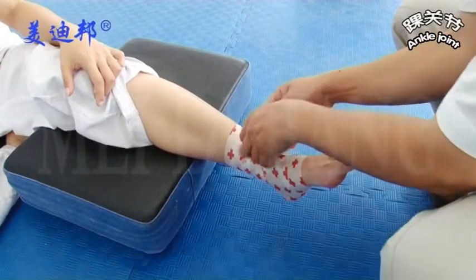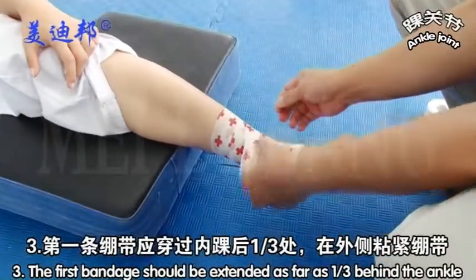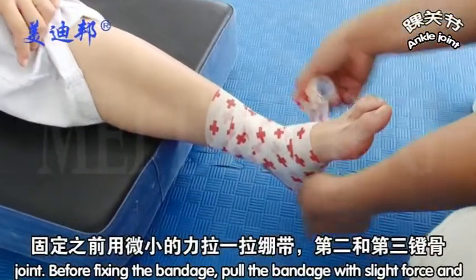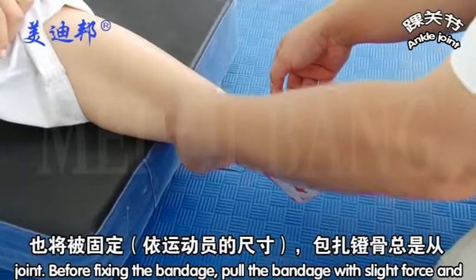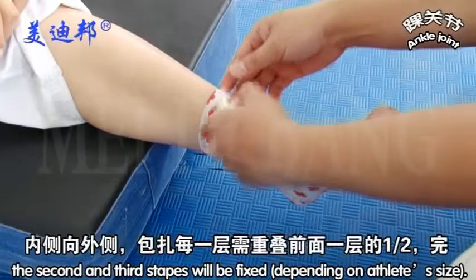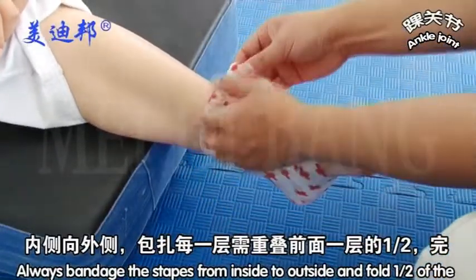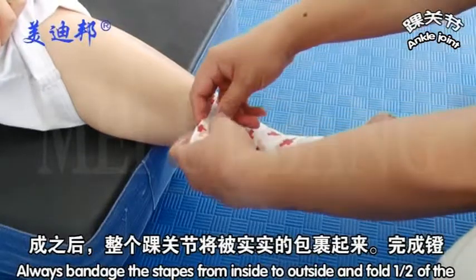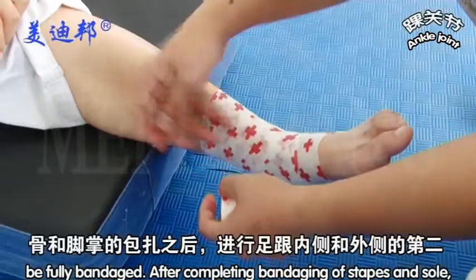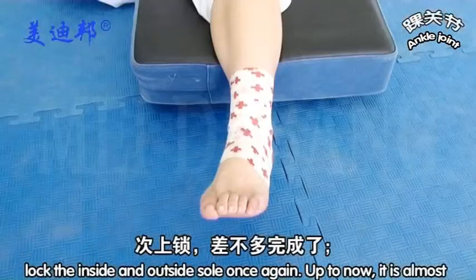Step 3: The first bandage should be extended as far as one third behind the ankle joint before fixing. Apply the bandage with slight force. Second and third strips will be fixed depending on ankle size. Always bandage the strips from inside to outside, and fold one half of the preceding layer when bandaging. The whole ankle joint will be fully bandaged after completing the bandage of the strips.